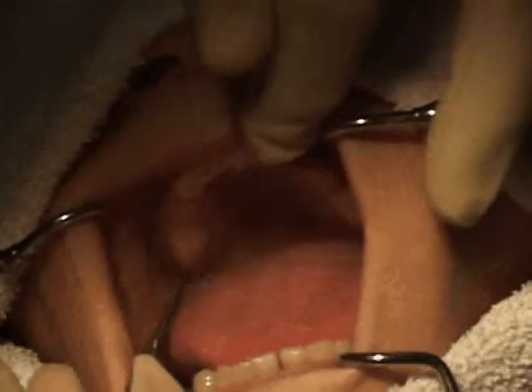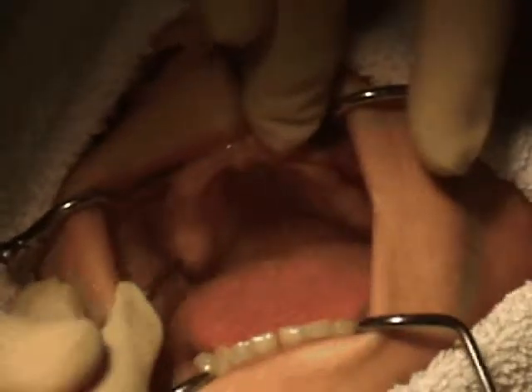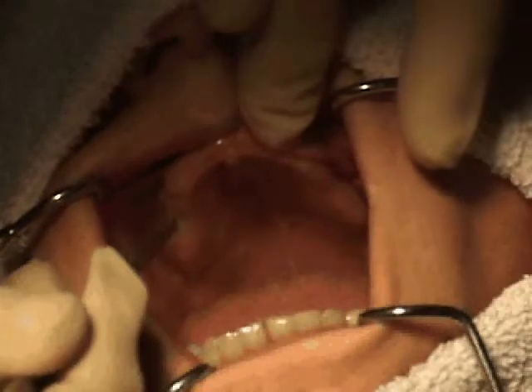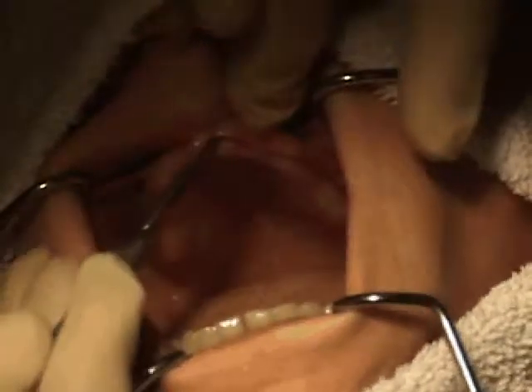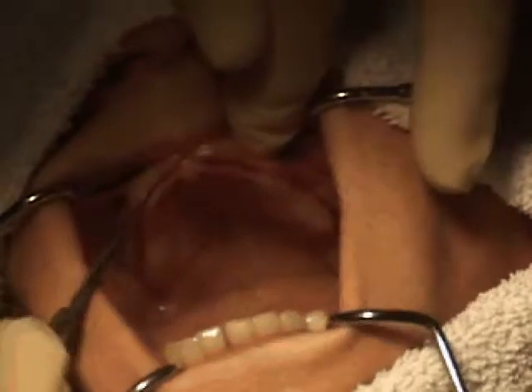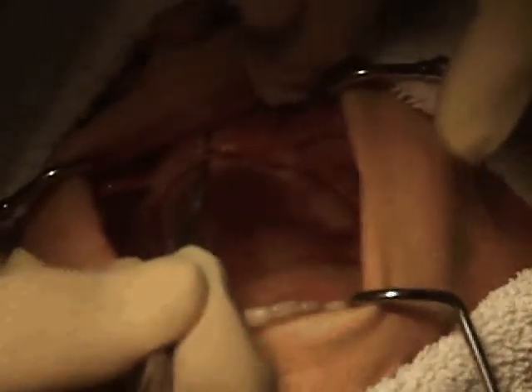Now we're moving to the right tuberosity, again angling the blade toward the buccal and trying to have the tip on the crest of the alveolar ridge and moving along toward the midline. Now we're cutting the midline relieving incision starting at the nasal spine and connecting it to the incision at the midline.